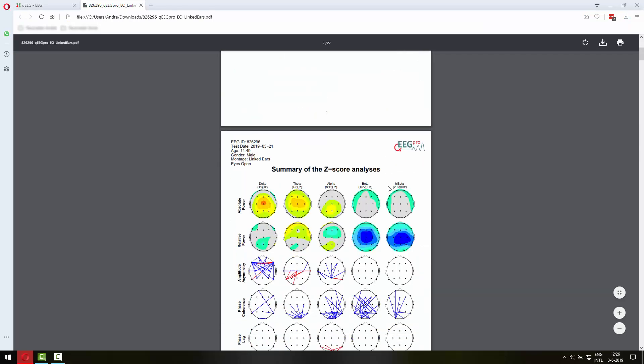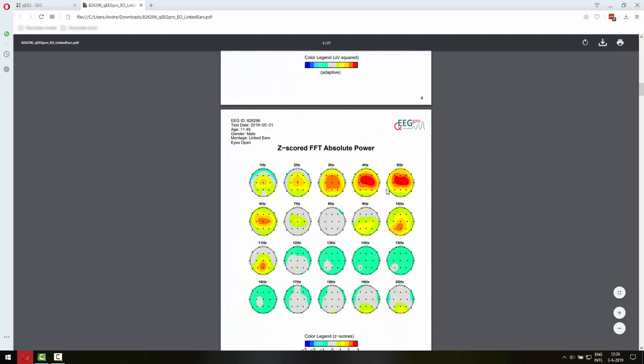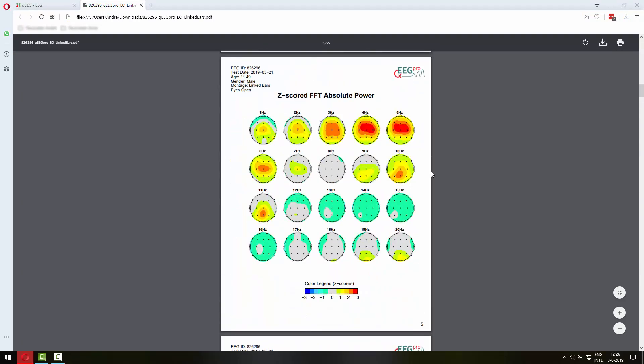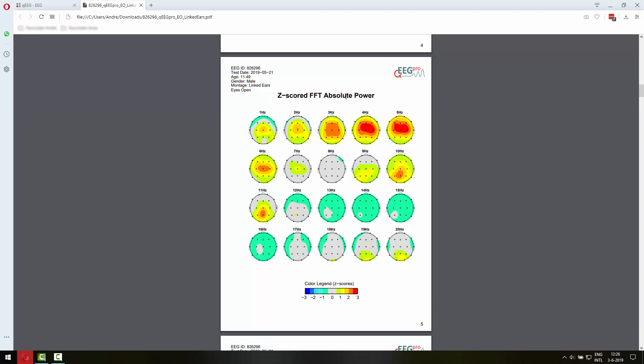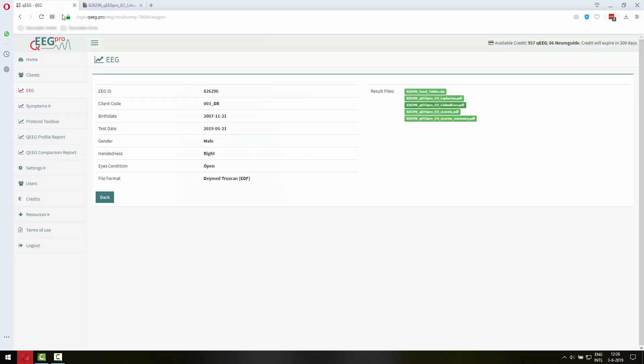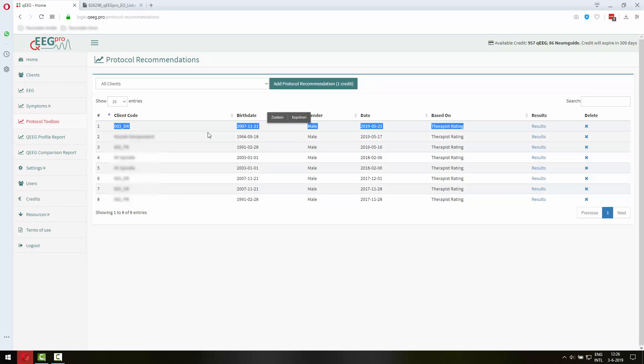From the maps it is clear that this person has an excess in delta and theta, predominantly an excess in theta. So that will probably be the protocol recommendation as well. So let's go to the protocol toolbox and here we have the protocol recommendation for client 003 underscore DR.